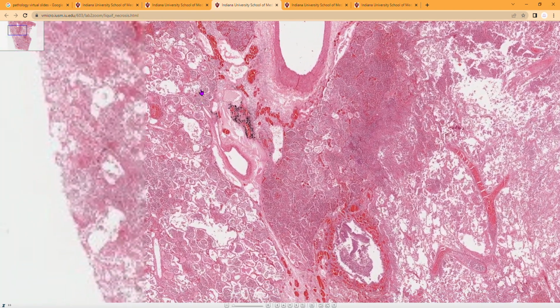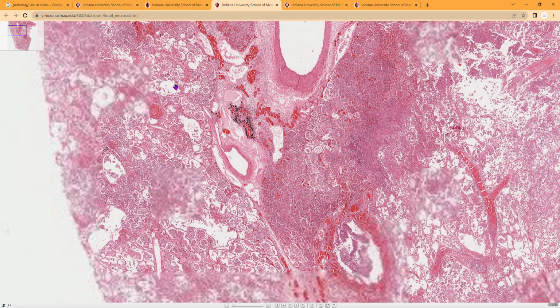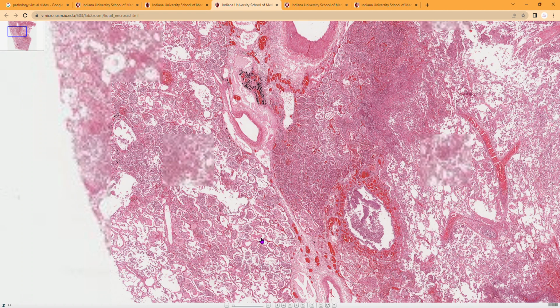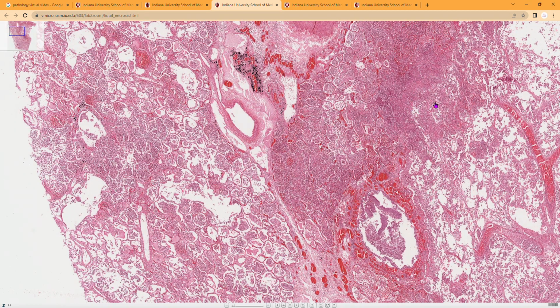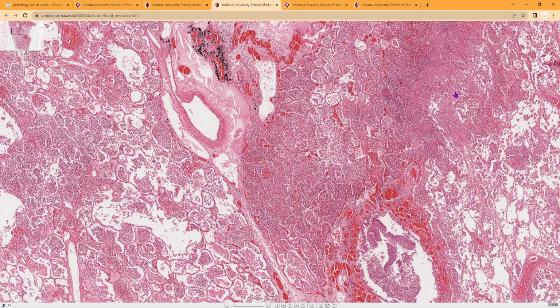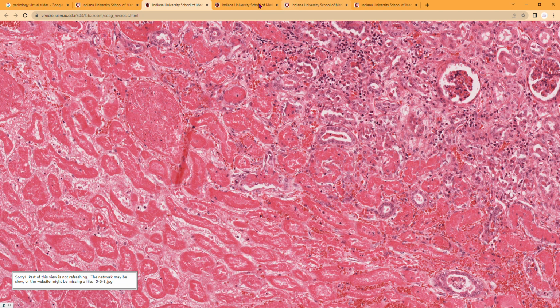Basically, you can see the normal configuration of lung here. You know already that the lung is supposed to not have anything inside there. It's supposed to be empty, all right, but this one is not really empty because this is a lung with pneumonia, which has lots of neutrophils inside there, meaning there's infection. But here you can still see the alveolar spaces. Compared to here, this is a bit more dense with inflammation inside the alveoli, but compared to here, you cannot see the alveoli at all. So when there's a destruction of the tissue parenchyma, this is what we call liquefactive necrosis. So you can take an image and label this area as liquefactive necrosis. Sorry, to remind you again, you can take this image and show where the areas of necrosis or loss of nuclei are in these slides.